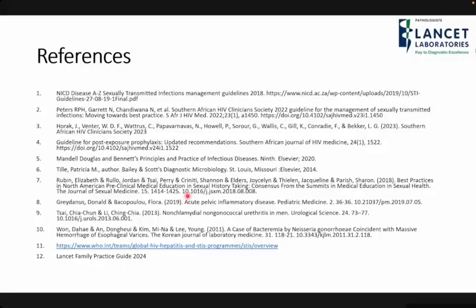Yes. One last point. Oh, okay, Dr. So you said for genital ulcers, the best thing is to swab or urine? So for genital ulcers, the best thing is to swab the ulcer itself, so to swab the lesion. And if it's a vesicle, just swab the vesicle. If it's an ulcer, swab the ulcer. That's where your organism is concentrated. Here you're referring only to syphilis and herpes. Herpes, yeah, only those two.